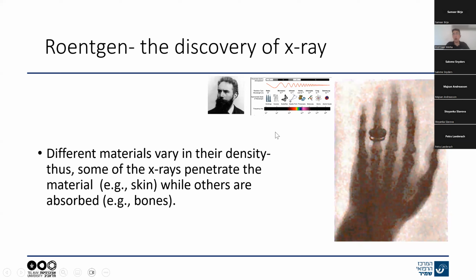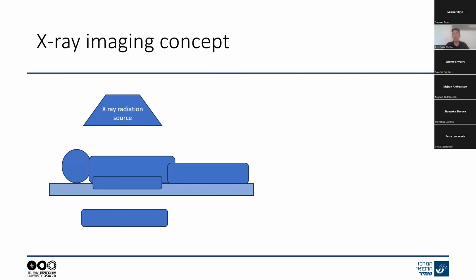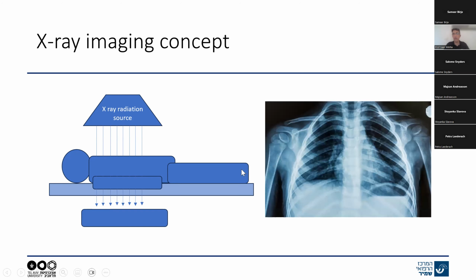I'm sure all of you are aware of what X-rays are. Some of you underwent one, or just saw it in movies, or maybe on yourself, a simple X-ray. So this is what we do when we use X-rays. There's a source of energy at the top or at the bottom, it doesn't really matter. The body sits between two plates: you have the source of energy at the top, the material, the body in this case, in the middle, and then at the bottom some sort of film. Today it's all electronic, but some sort of material that will absorb the energy. As we said, the X-rays will have different penetration and will come out as an image on the other side, depending on the density of the material. This is how it really looks, and this is the image that we get.